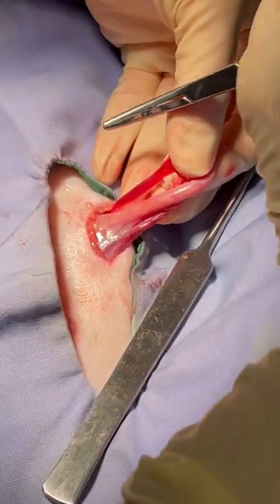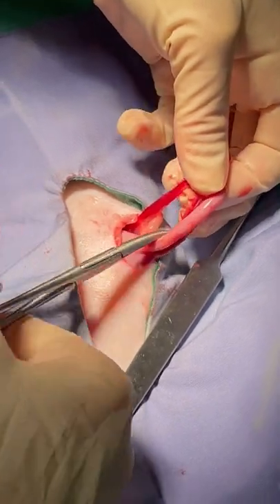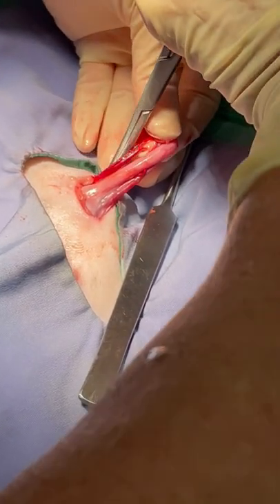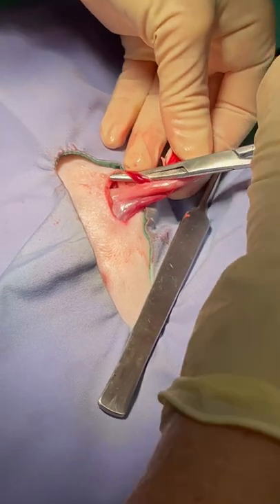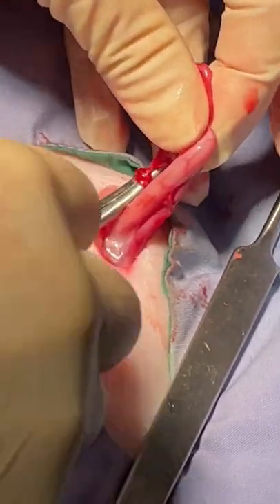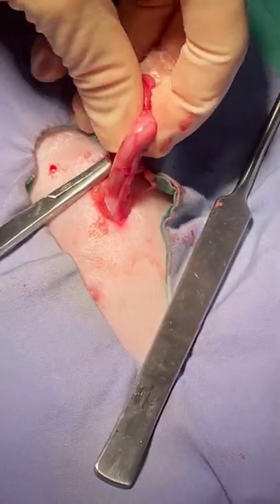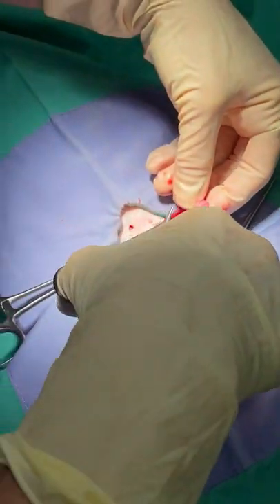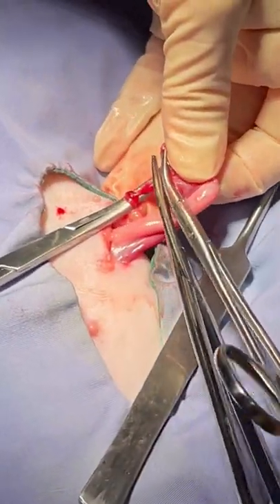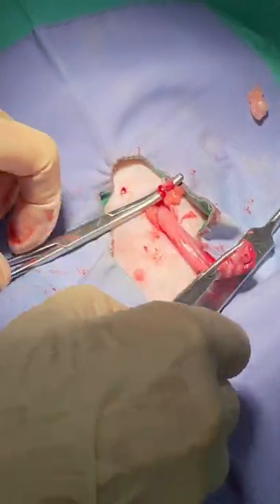Now for the method of tying off — I'm giving myself the most room I can. I made a hole in the broad ligament and cut the suspensory ligament. Now I'm going to hold this in an awkward position, parallel, facing down, go behind it, turn it, open it, and grab this tissue right here. Now I have a knot. I'm going to clamp this so that it doesn't bleed when I cut it, make sure there's nothing else between here, and I'm going to cut this. I've now cut off the ovary and the horn from the blood vessels.